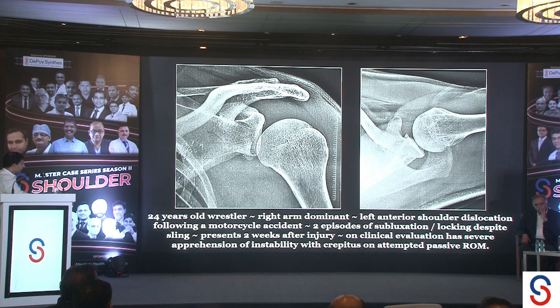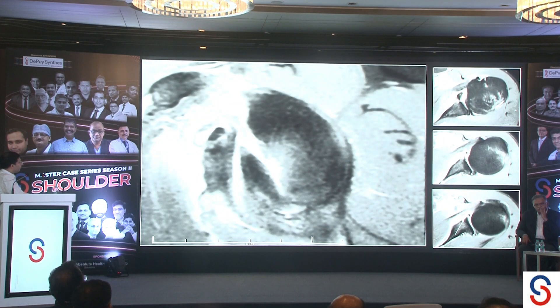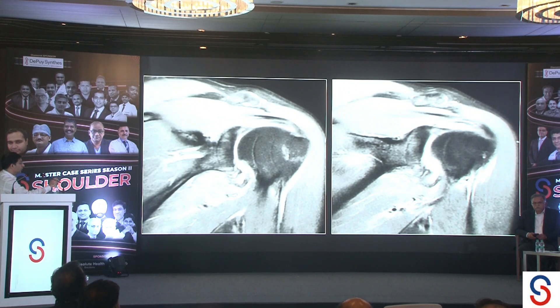On MRI, we can see a large bony anterior rim fracture — a bony Bankart — with the humeral head appearing well centered. In addition, he also has a posterior labral tear. So there is an anterior labral tear with the bony Bankart and a posterior labral tear. The superior labrum does not look good at all, and while the biceps anchor is okay, I suspected some superior labral pathology. His rotator cuff is alright.